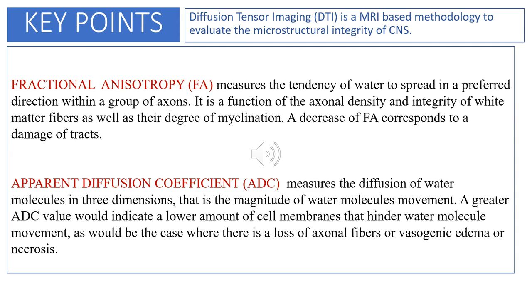ADC, apparent diffusion coefficient, measures the diffusion of water molecules in 3 dimensions. In other terms, an increase of ADC indicates a damage. It is the opposite of the fractional anisotropy.